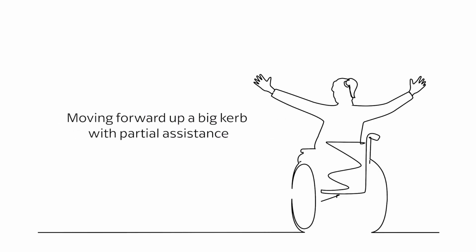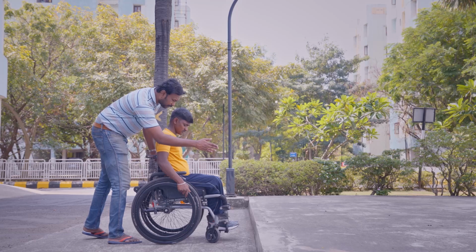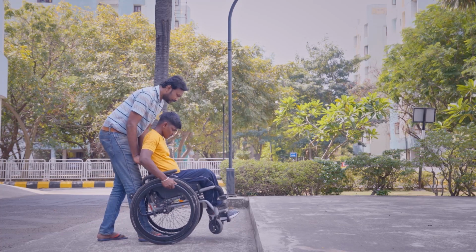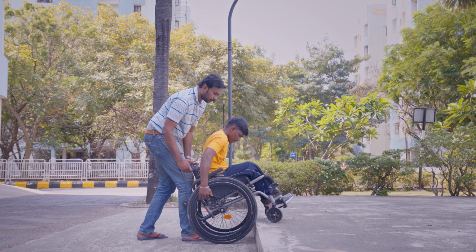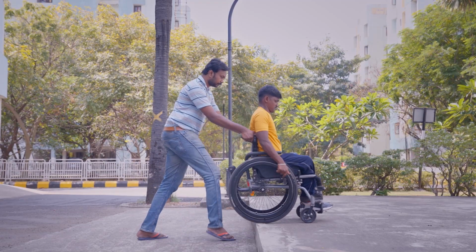Moving forward up a big kerb with partial assistance. To move up a big kerb in forward direction with partial assistance, hold the push rims at the knee level and have an assistant stand behind you. Now, the assistant should pop the casters, maintain the wheelie while moving forward, and drop the casters on the kerb as the rear wheels touch the edge of the kerb. Now, on count of 3, push the rear wheels forward with a sudden force and climb the kerb as the assistant supports the wheelchair.